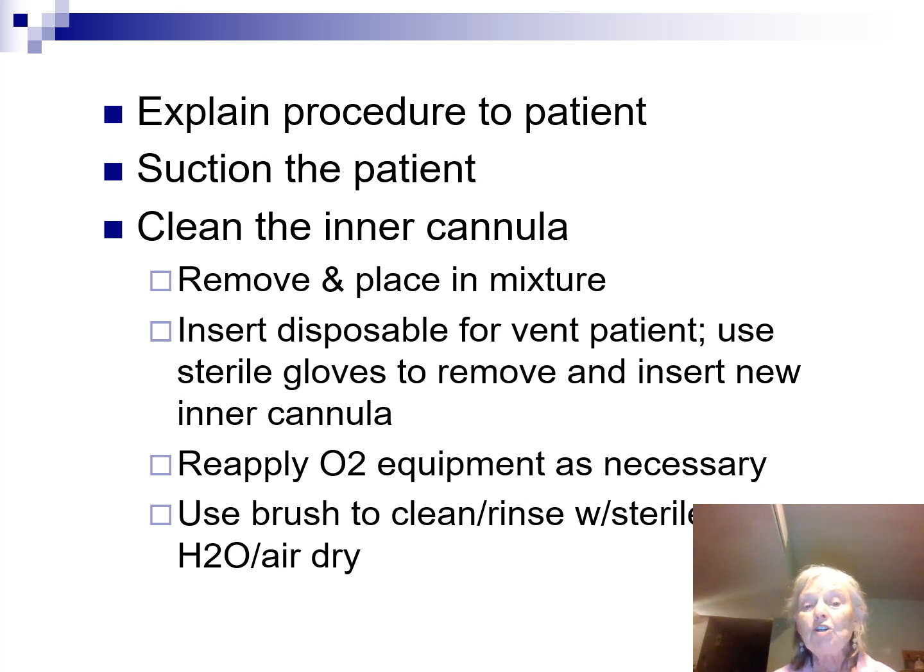We can use the brush that you saw to clean the inner cannula out. Do not use the brush on a patient's skin, though. If you have a lot of secretions on the flange, you can take that brush and actually, holding that flange, go ahead and brush around that flange, especially on the top, and remove or loosen up the secretions. And then we can take either a gauze pad or we can take the sterile Q-tips and we can go ahead and rinse around it. Once you've used the gauze, once you've used the sterile Q-tips, those get tossed into the trash can. We do not reuse those.